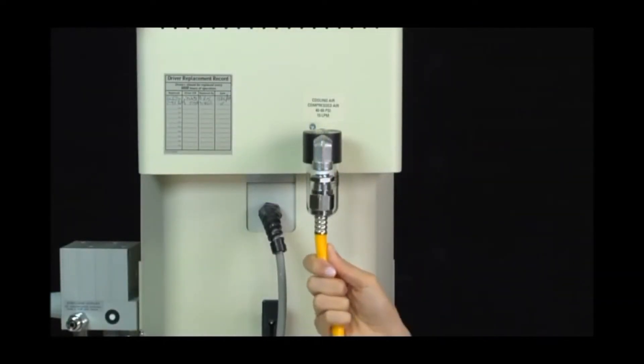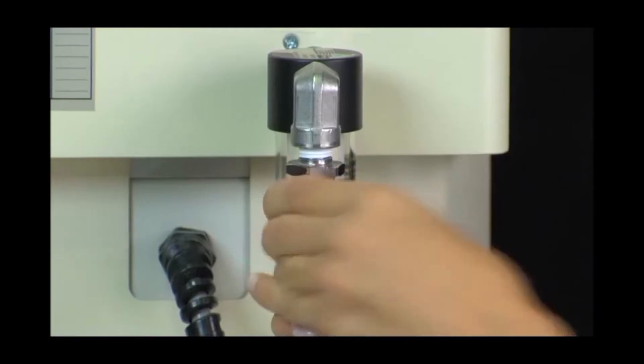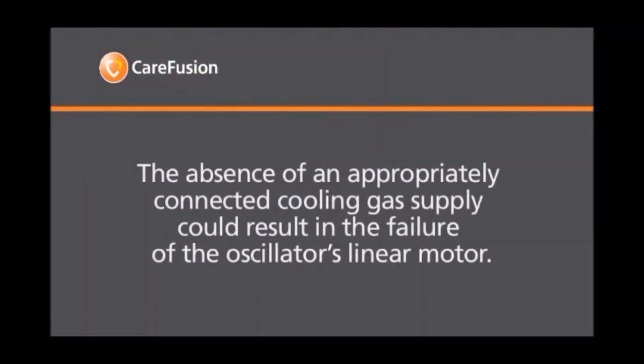A second DISS connection is labeled cooling air. This connection accepts a 50 psi compressed air supply, which cools the oscillator. It's important to note that the absence of an appropriately connected cooling gas supply could result in the failure of the oscillator's linear motor.